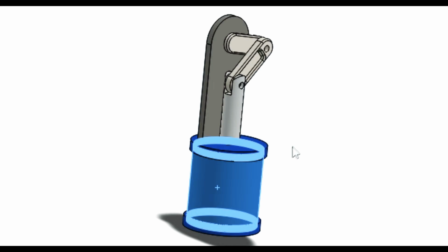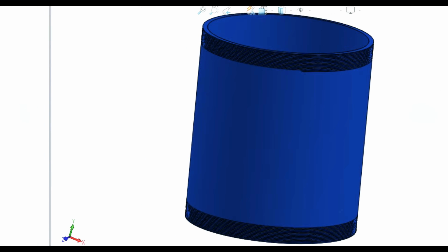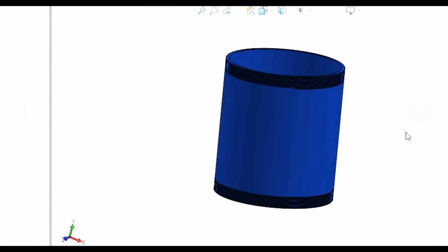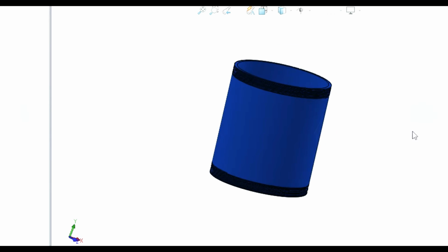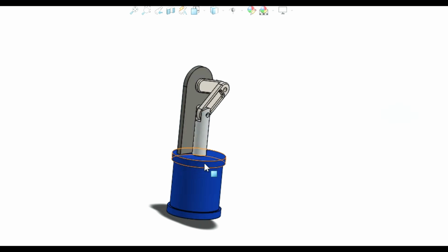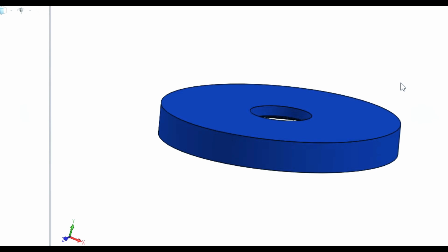It consists mainly of a cylindrical part, which is a hollow tube that can be made out of simple parts like PVC pipes. These PVC pipes are threaded externally at the two ends, and can be fitted to PVC pipe caps, which are readily found in plumbing accessories shops.